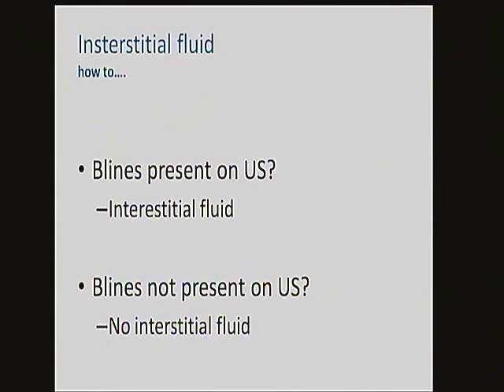Well, this is, and I'm going to talk a little to you about B-lines. Does anyone know what B-lines are? Have you guys heard that before? Yeah, that's right, the B list. Yeah, the other Vicki Noble, not this Vicki Noble.